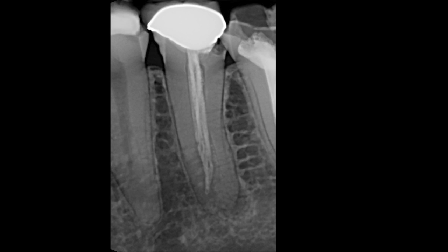This is tooth number 20, and as you can see, this tooth has been treated with a very poor root canal fill. There is a lot of space around this root canal fill that is poorly condensed. There is coronal decay around the crown, therefore the crown has to be changed. If you look here, you can see that there is additional anatomy on the side of the tooth that reflects a potential additional canal, or maybe two.